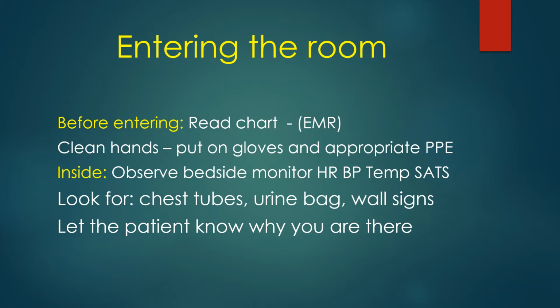Let's say you're monitoring the patient's ventilator and the alarms start going off, and you look up and his heart rate is 110. Well, did it go up? You won't know if you didn't look at it before. If you walk in the room and see his heart rate's 110 and the alarms are going off, that's one thing. But if you walk in the room and the heart rate is 70 and the alarms are going off and now the heart rate says 110, that would indicate a more serious problem that you need to try to figure out.